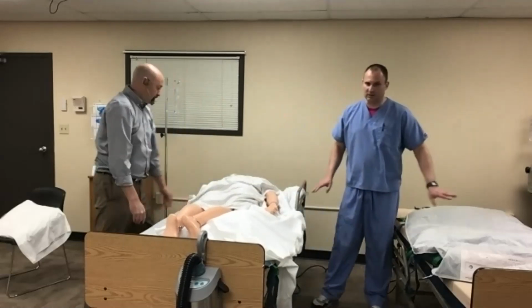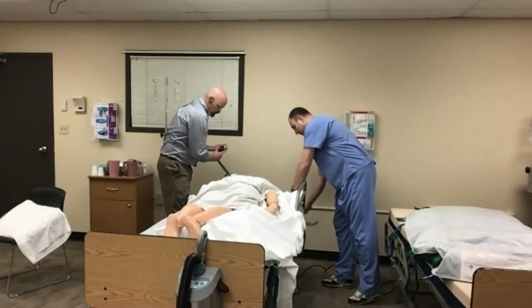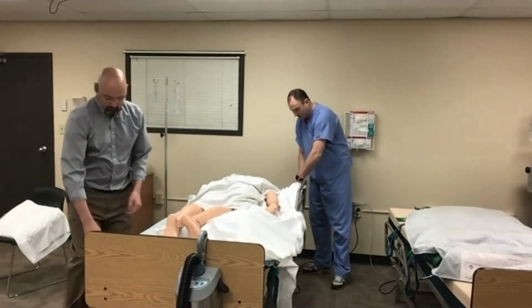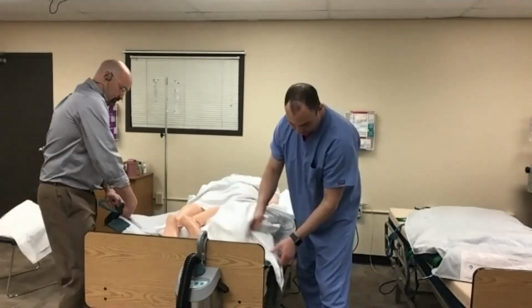So we're going to repeat the process. We're going to unhook this, which stayed in place nicely. And then we're going to put the HoverMatt back underneath him and reattach it. And then we'll bring him back to supine.